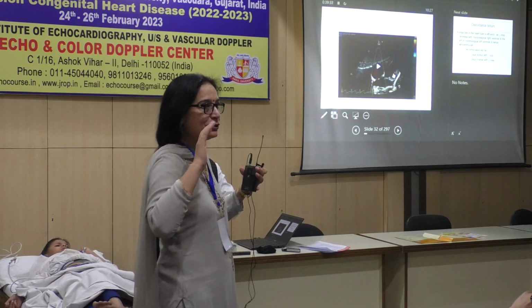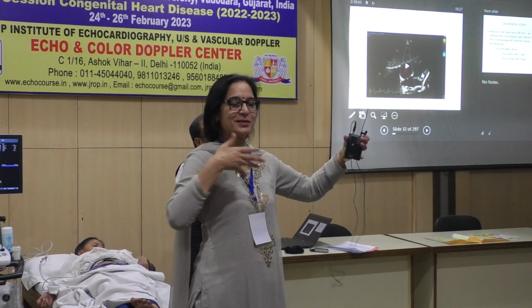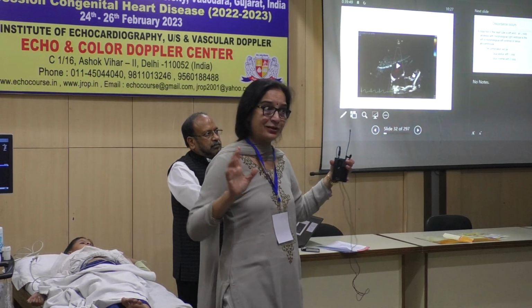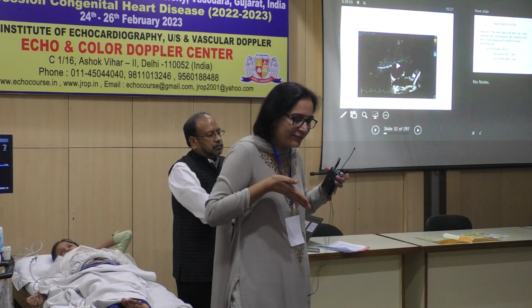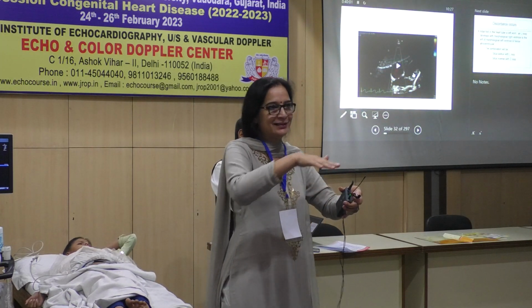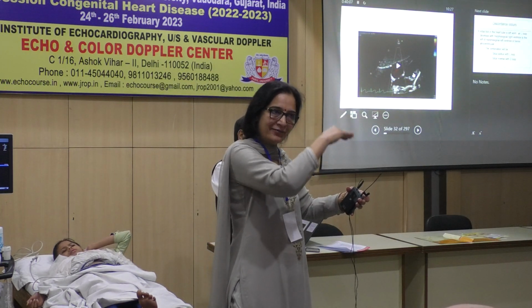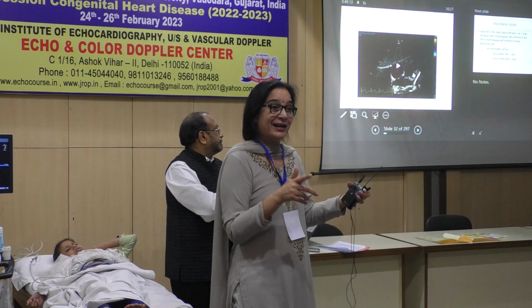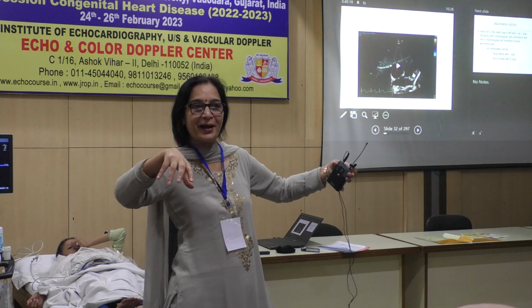That is the importance of each segment in the congenital cardiac approach. You need to take your time. I was dealing with situs inversus, and suddenly the LA is there, the RA is there, systemic veins are on the RA, pulmonary veins on the left atrium, very typical. The appendage and everything fitted situs solitus for the atrium, but abdominal and bronchus were situs inversus. Then when I moved to the ventricle, there was reverse offsetting. So you think it is corrected TGA? My left-sided AV valve was at a lower level and the right was higher. Reverse offsetting clearly, but the left-sided ventricle was smooth, the right was trabeculated, and the moderator band was on the right side.